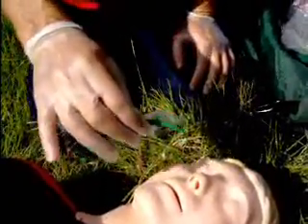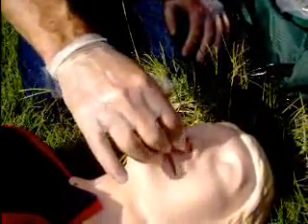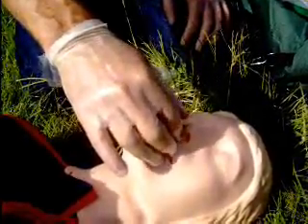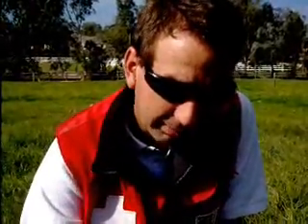Now, airways you don't want to force because there is some probability of pushing the airway through the sinus and into the brain and causing death. So be careful as you put it in that you put it in and rotate it in and it goes in smoothly. Tell them about the angle of the opening in the airway.